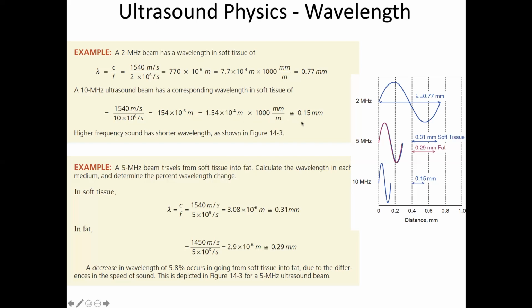So now we've got pressure waves that are really on the order of some of the things we're trying to measure, like a vessel, or the mitral valve in the heart, something like that would be on that scale. So this shows you the answer to the earlier question: what frequencies of sound are we talking about here?